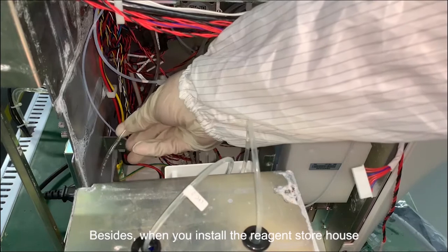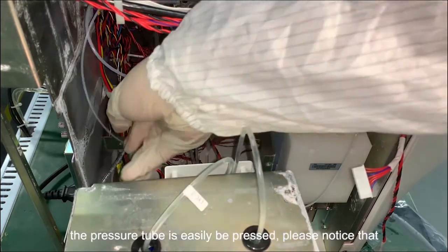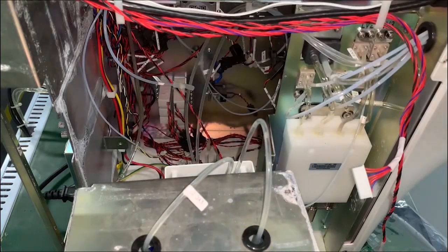Besides, when you install the reagent storehouse, the pressure tube can easily be pressed. Please take note of that.